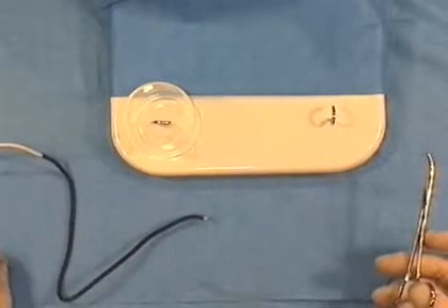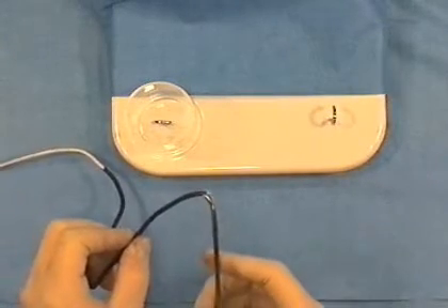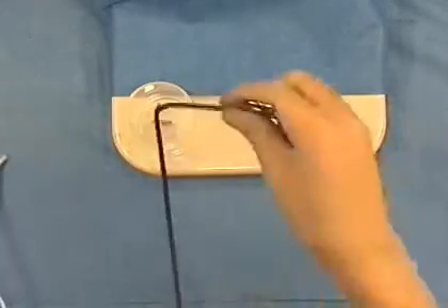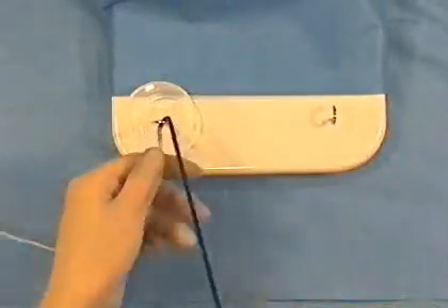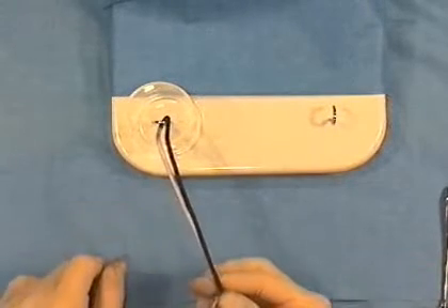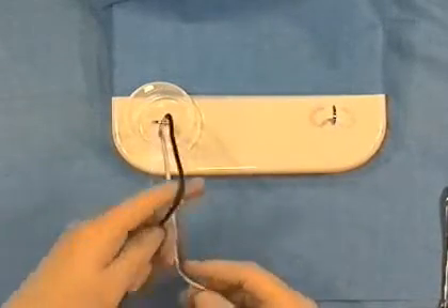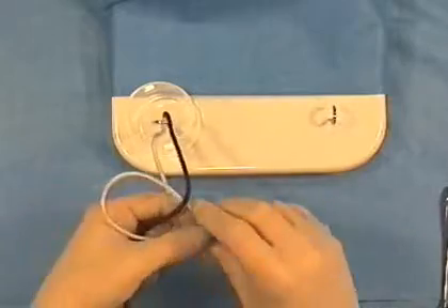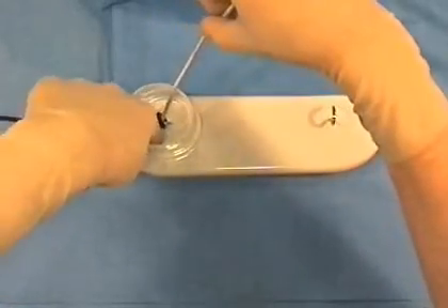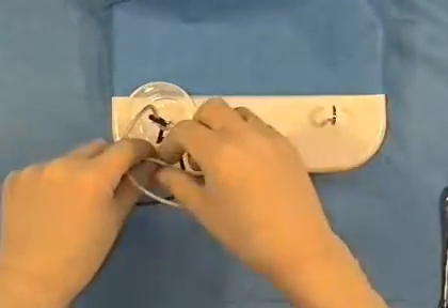Sometimes, it is necessary to tie a knot at depth. To do this, the surgeon should bow the knot around an instrument as shown. The suture should be placed around the vessel using the instrument so that the surgeon's hands do not obscure the field of view while placing the knot. The knot should then be tied gently with one finger passing beyond the blood vessel. Never tug on the suture as this may cause the ligature to slip and result in a profuse hemorrhage.